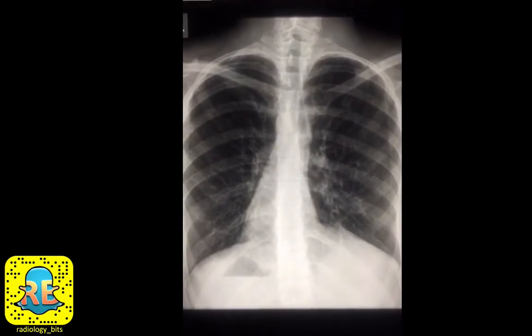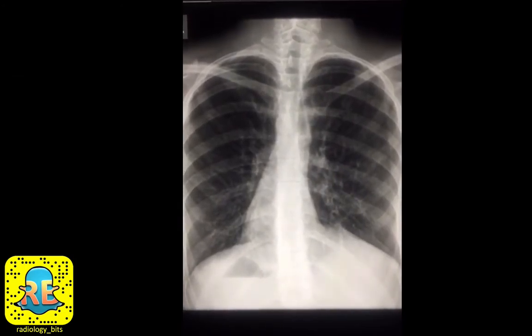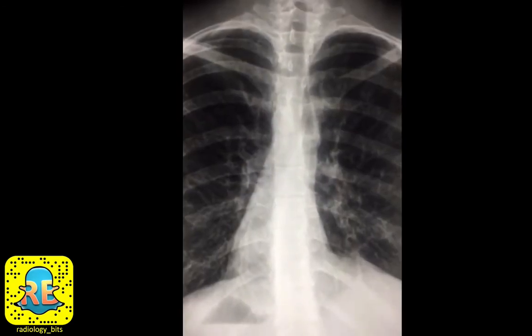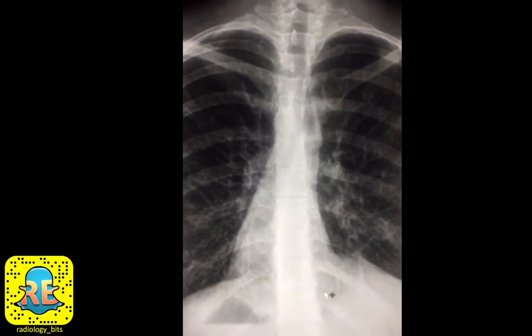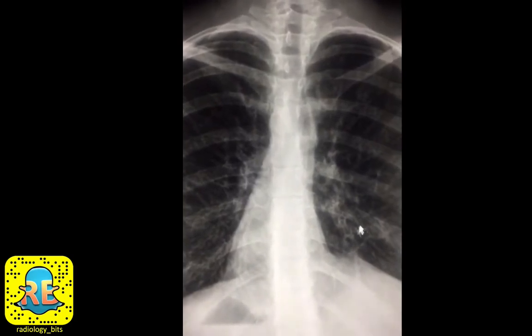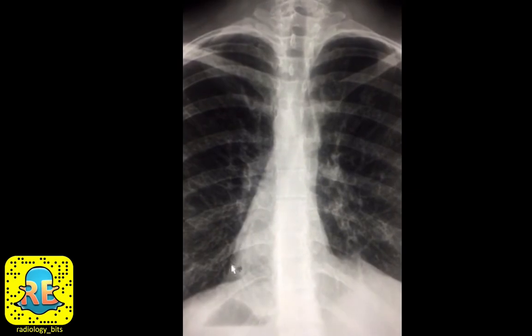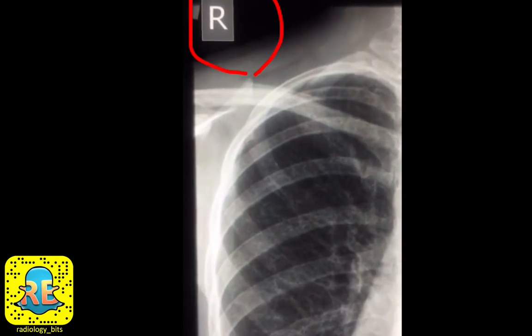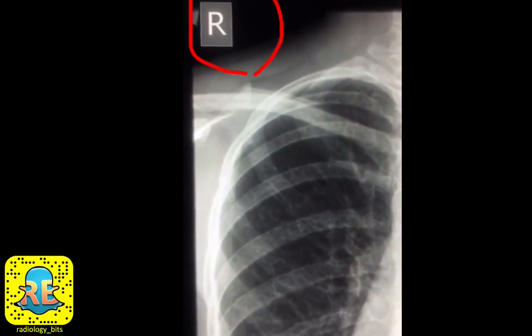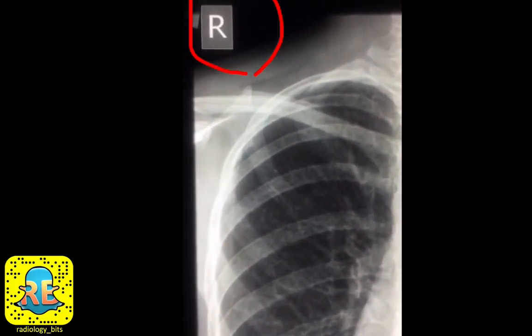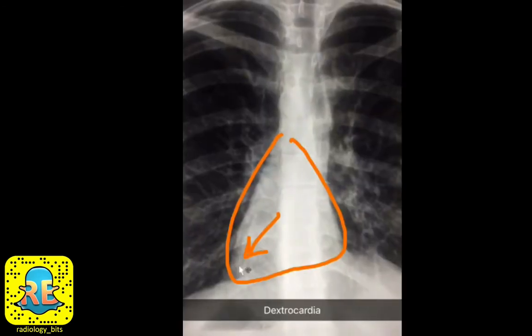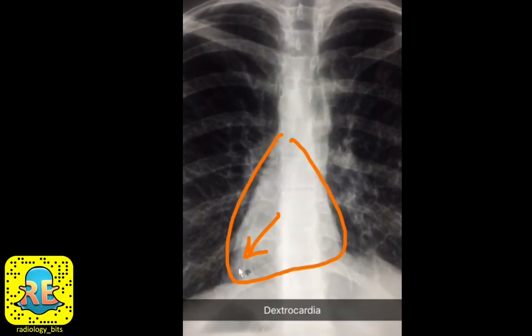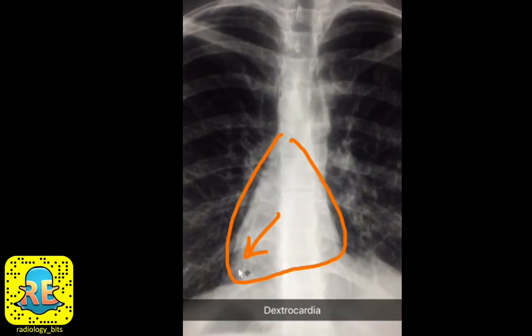Welcome again, everybody. This is a quick classic show-and-tell case. The first thing you'll notice is that the cardiac shadow is not in its normal location — instead of having an apex on the left, the apex seems to be directed to the right side. Before jumping to conclusions, make sure that the technician labeled the x-ray correctly, where right is right and left is left — and that's the case here. After double-checking, you have a right-sided cardiac apex, which is termed dextrocardia.